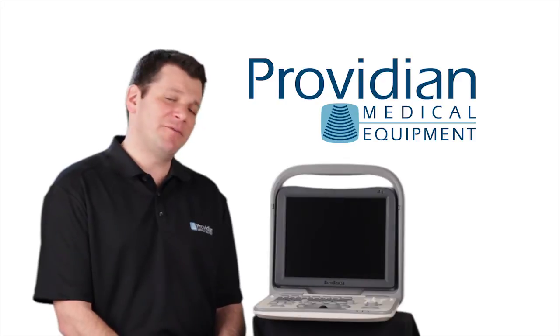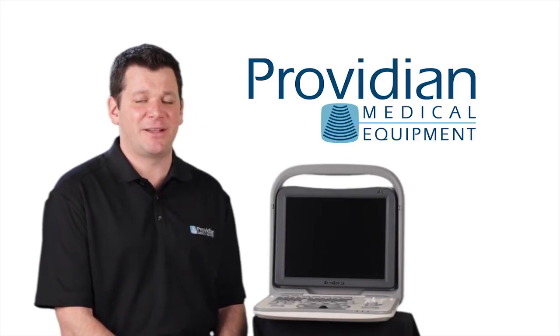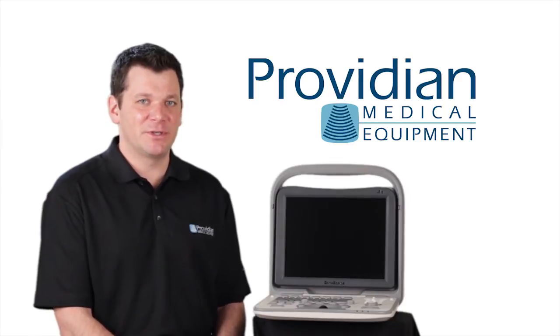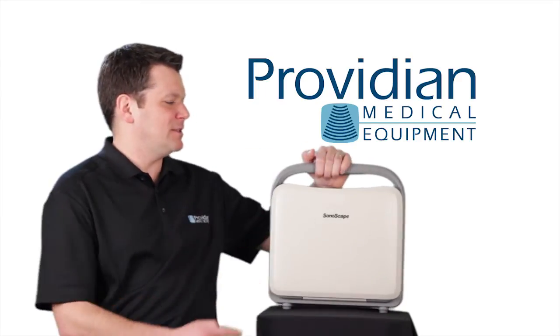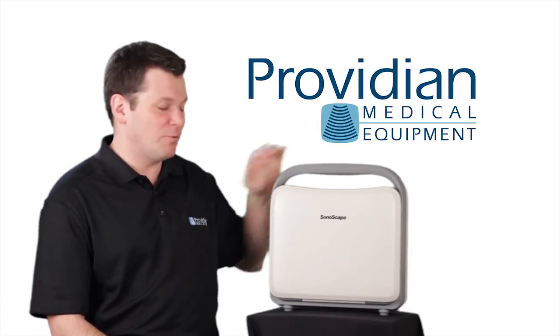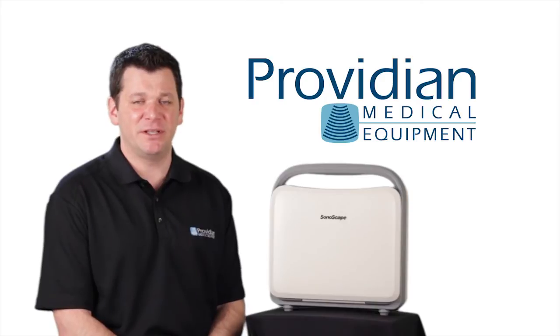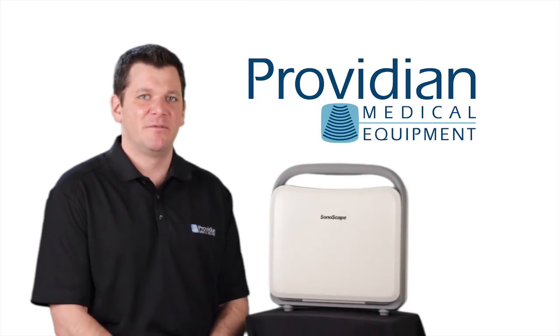It also has battery life that runs up to three hours, and I actually did test that and it ran just about exactly three hours. So it is a very versatile ultrasound machine, it's easy to carry around, very lightweight, and really nice for a lot of applications — especially for those with a tight budget. This is an excellent machine for your practice.